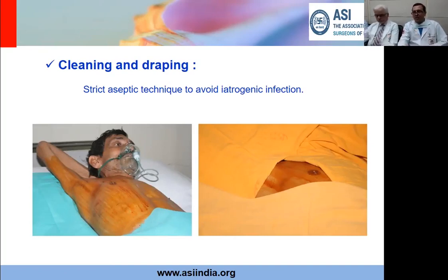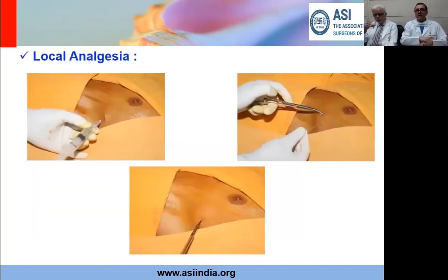Please do get extra drapes and please see that this area is covered properly. Next step comes a local analgesia. It's important that you first choose the site. Okay, this is the site in which I'm putting the chest tube.